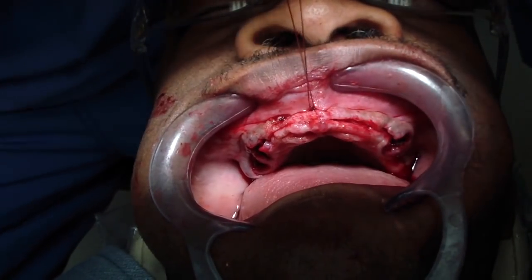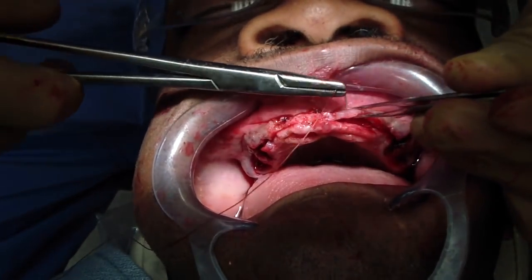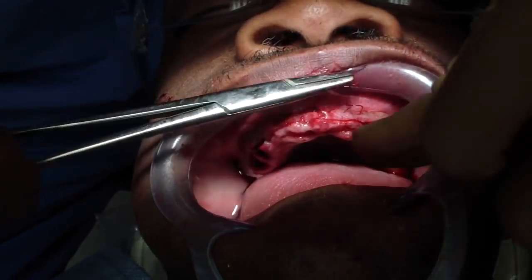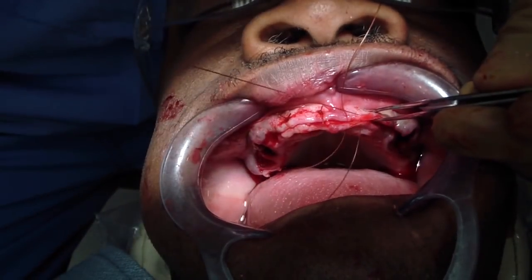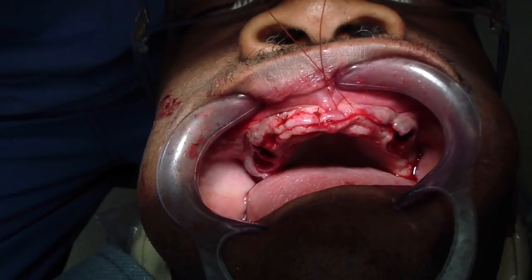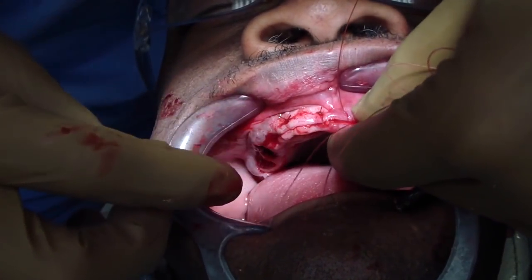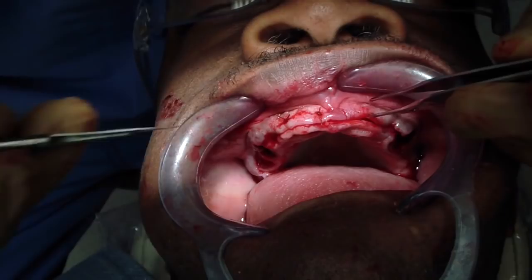I initially followed that clinician's advice and didn't remove any of the soft tissue. After my suturing, I started to feel like there was a significant amount of excess soft tissue. So right about here I decided to remove the sutures and remove the excess soft tissue. How much do you remove? That's more of a looks-about-right technique. You can see that just underneath is just a huge amount of flabby, excess tissue.